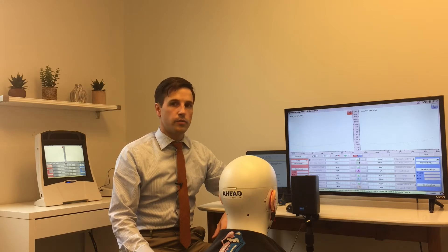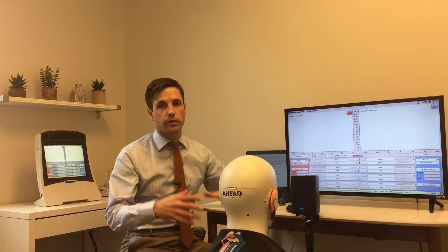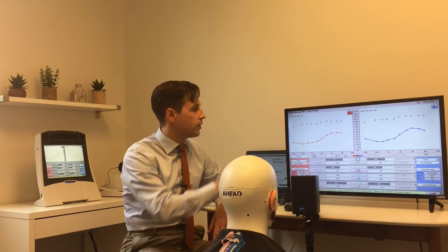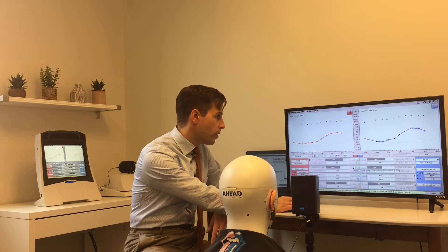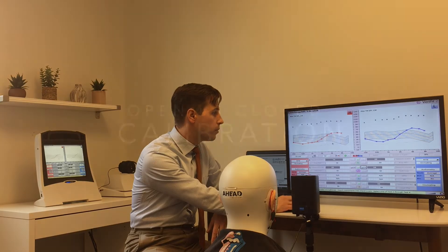This setup is a way for you and your client to see a little bit better so they can see how their hearing aids are helping them. We're using the AudioScan NOAH module just to send the data over, and you can see Carl's audiogram there. One thing I like to do is just throw up an unaided curve so that we can see what is audible and what is not audible.